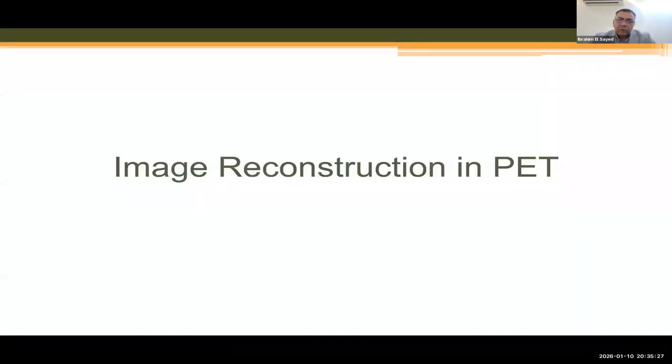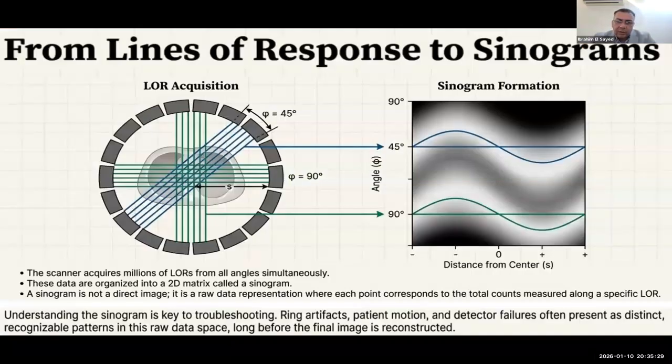Moving to image reconstruction, which is the hard part of this webinar. Given a set of lines of response passing through this, these are the sets of lines of response, okay? The blue ones and the green ones.